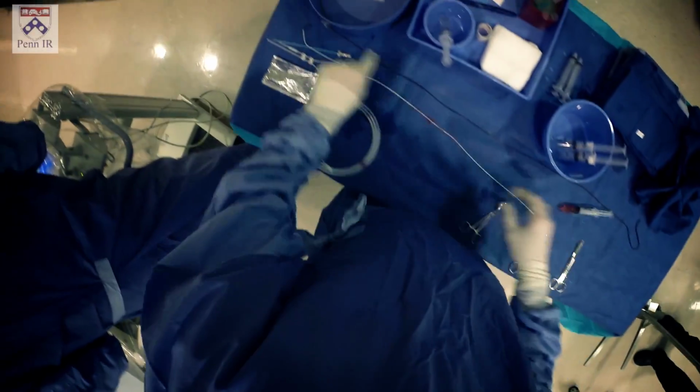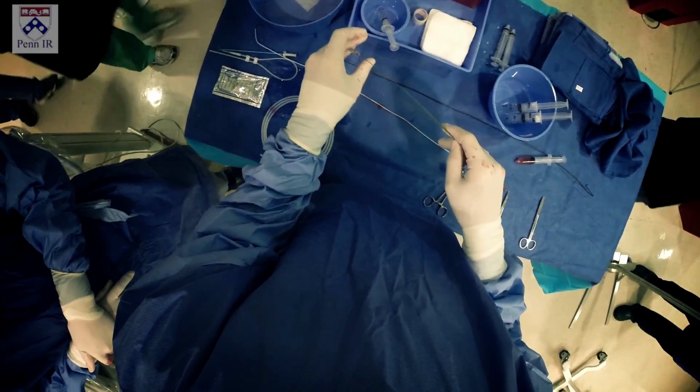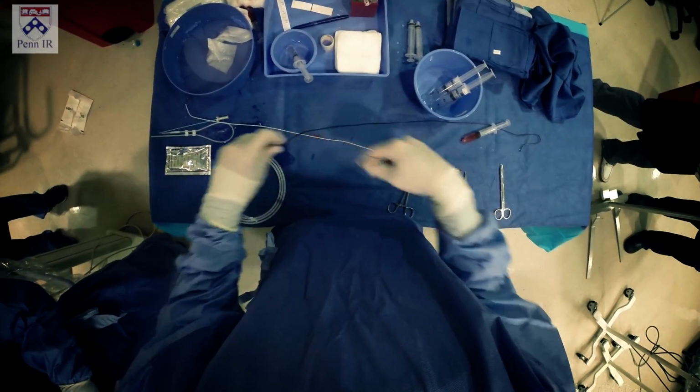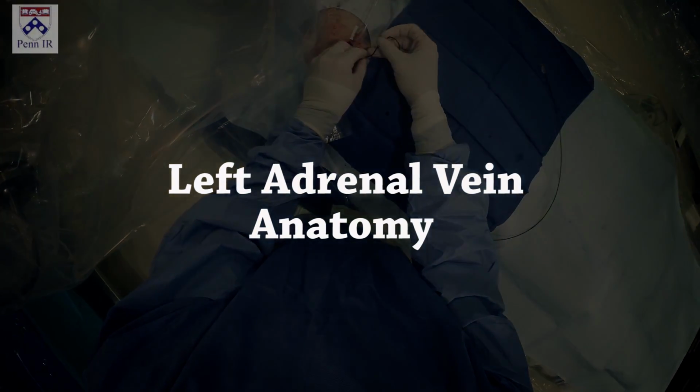We have a number of other quality assurance measures which include the timing of the specimen. Since we use a sequential technique, we always start with the right side, and then we go to the left side, and then the inferior vena cava. In addition to the labeling of the specimen for the location of the sample, we also have the time on the sample. So if there's ever a discrepancy, we can look and see whether the times look correct. Are they in the right order?